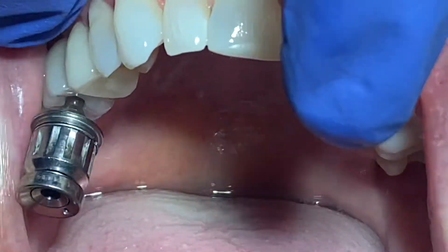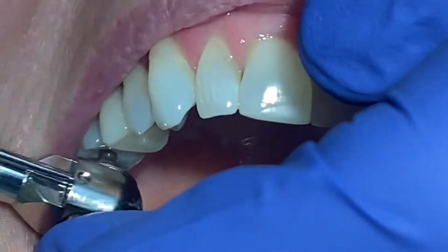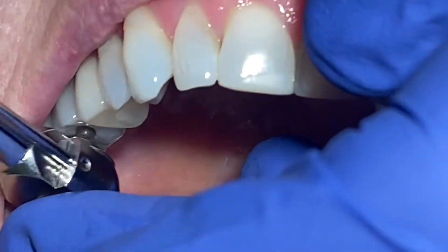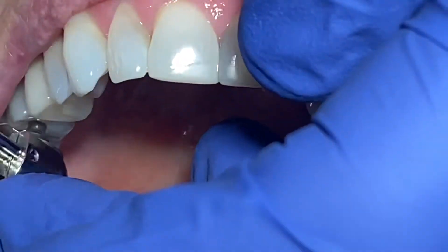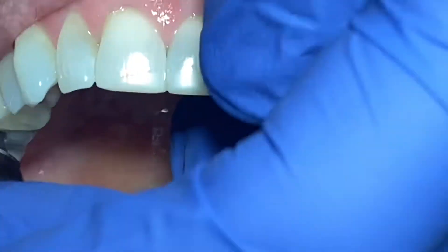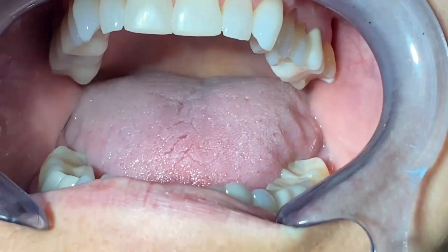Make sure you floss between the mesial and distal and confirm there's no gap between the gum and the crown. Then use the torque wrench and tighten all the way to 30–35 Newton centimeters, depending on your implant system. Check your bite and ensure there is no problem.